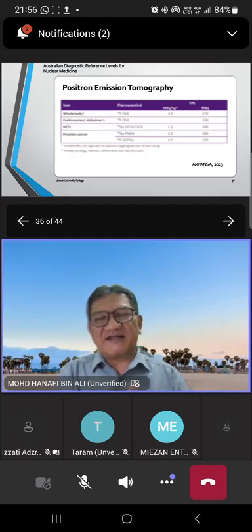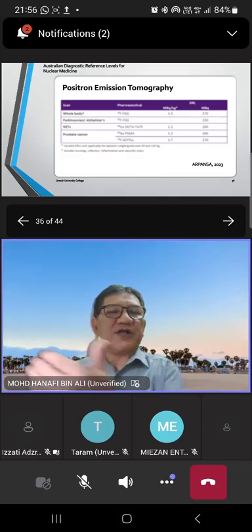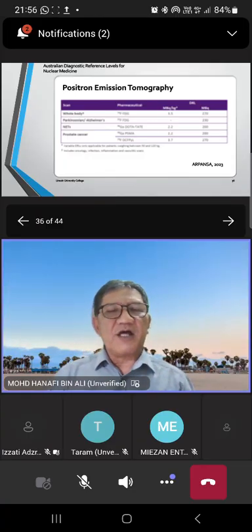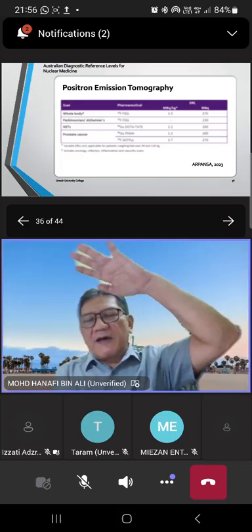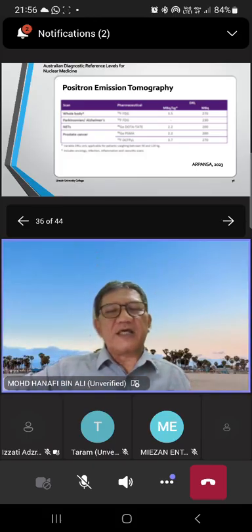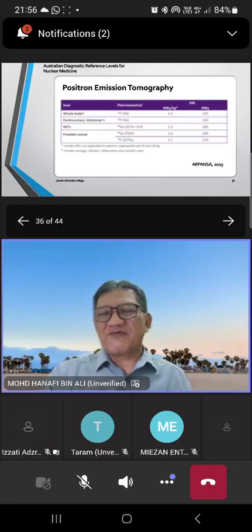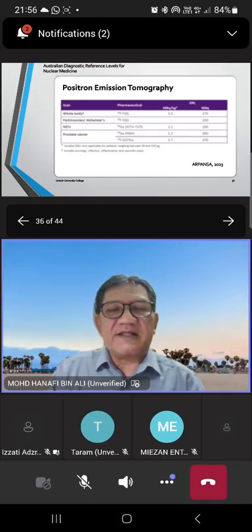If we look at CT scan dose compared to general radiography, general radiography is very simple. We use an ionization chamber, put it behind there, or now we have DAP, dose area product. Straight away we have a dose area product. After the collimator of the X-ray tube, we expose, and we can get the reading straight away with general radiography. But for computed tomography, we have a display, but that reading is just compared to the phantom, not the dose to pass through the patients. Okay, that's a slight difference.